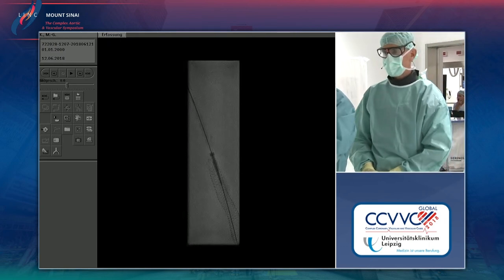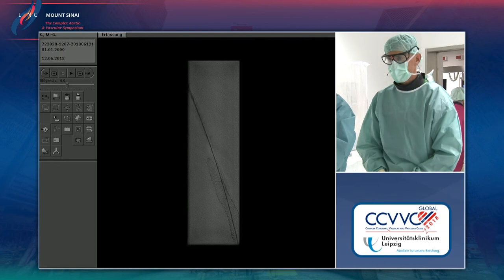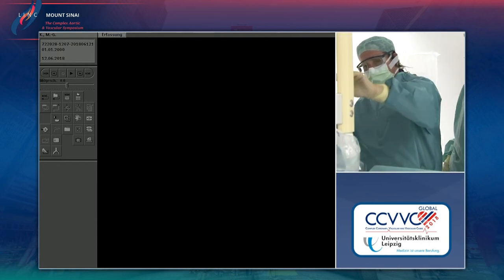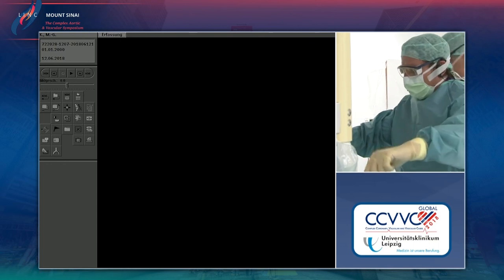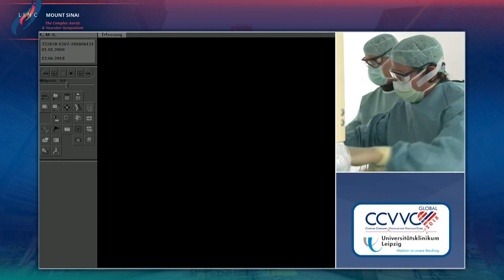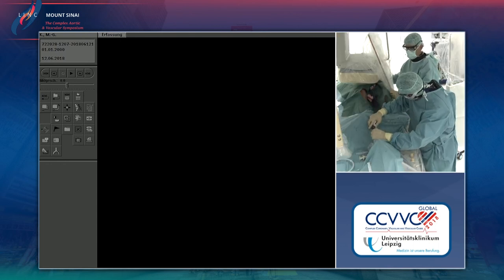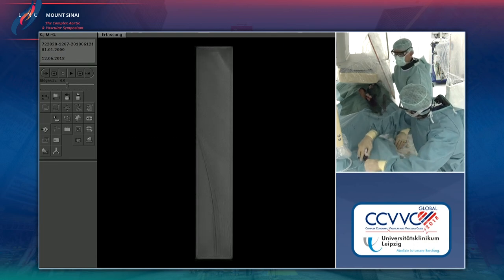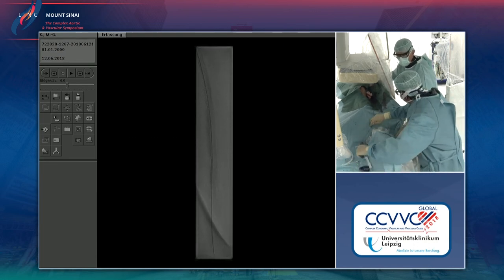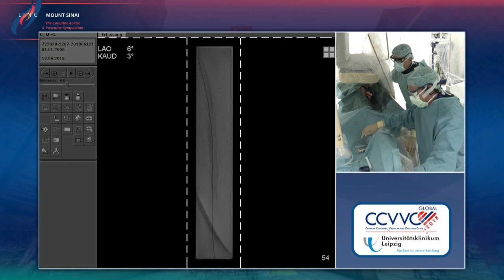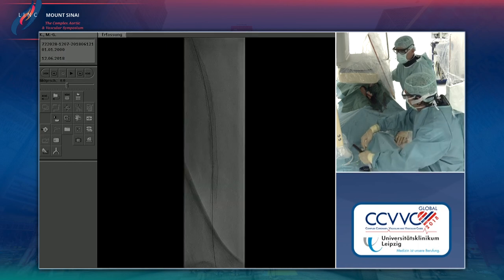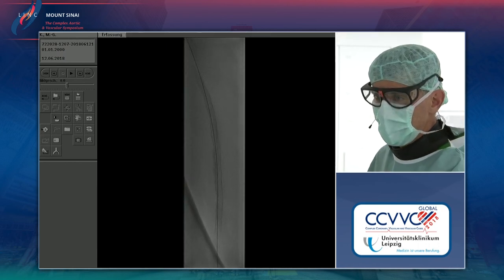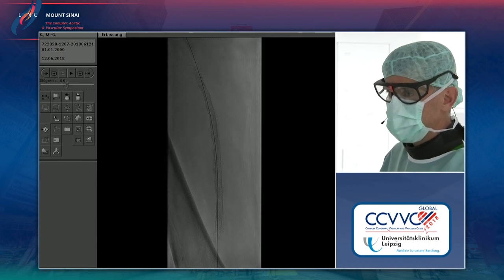Only this stent can handle the calcium — it will not collapse, it will not kink, it will always stay round and cannot be compressed by the calcium. More proximally it's not so calcified, and our plan is now to take a drug-eluting stent in there.